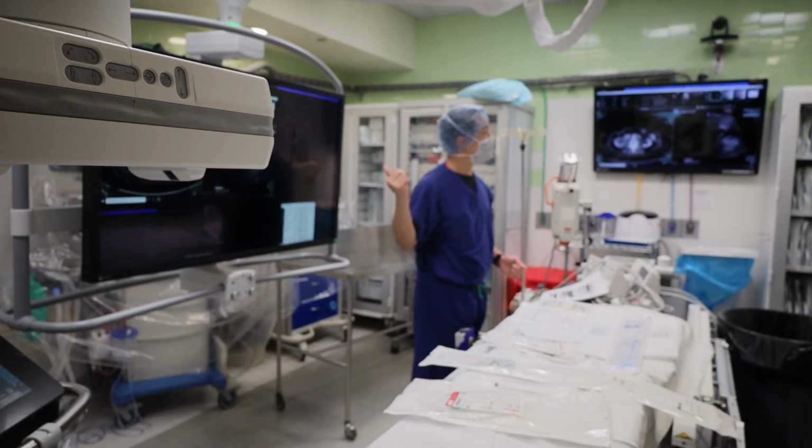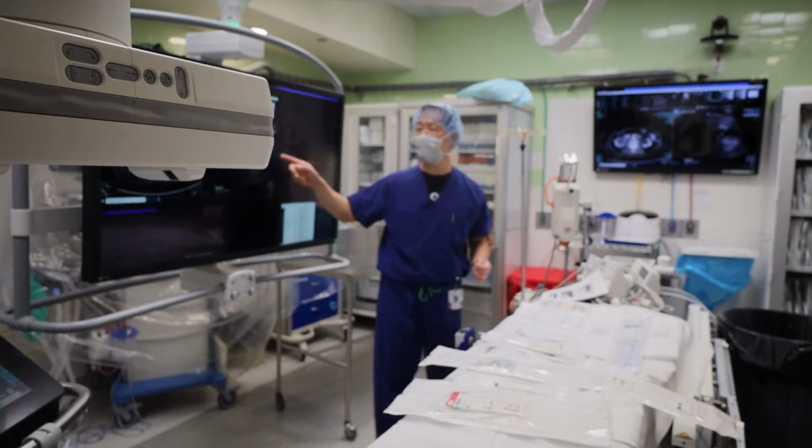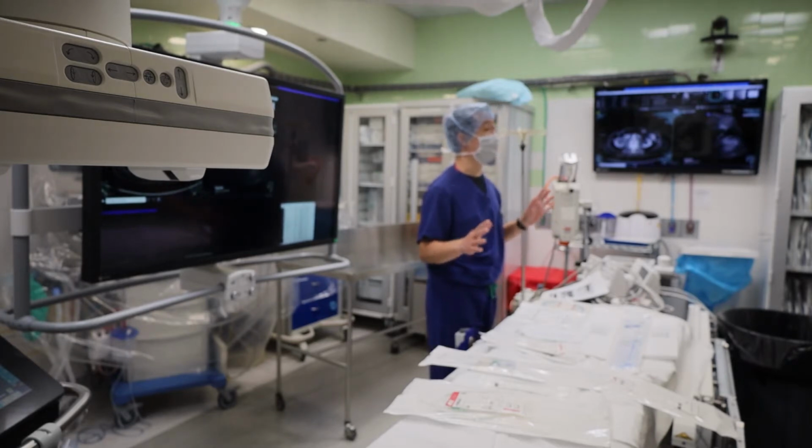Hard to know. If that were you, are you sure enough that this is your kidney to put a tube into? That's the question in my mind. And that's why oftentimes when we're not sure, I would say, let the doc know, "Hey, this doesn't really look like a normal kidney based on how comfortable you feel. Do you mind coming to a scan?" Totally cool, right? Because what we don't want is to be faked out.